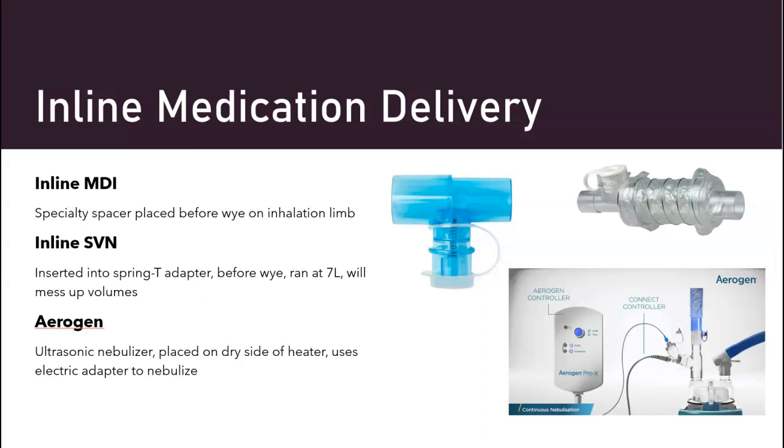It only takes a couple minutes, but it's kind of like your 3 or 4 minutes at the start of your shift to check those things, such as, does my patient look nice? Triple check your tube. Work from the patient back to perform your assessment to make sure that tube's in the right place. It's not pulling, because otherwise it's going to pull in their throat and that's going to be uncomfortable. That your tubing looks nice. Everything's clean, tidy, all while that nebulizes, and then you can perform your vent check at the end after everything's said and done.